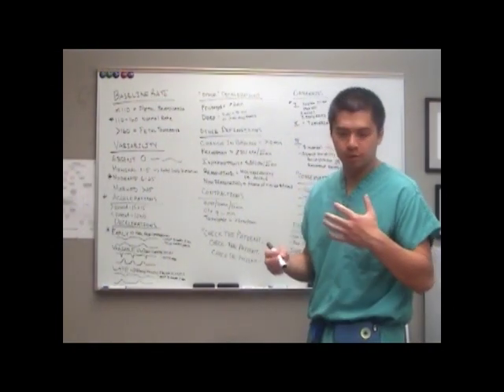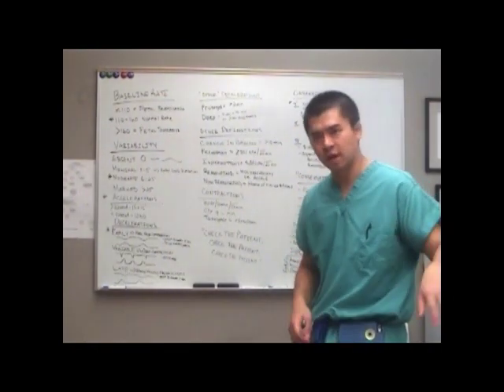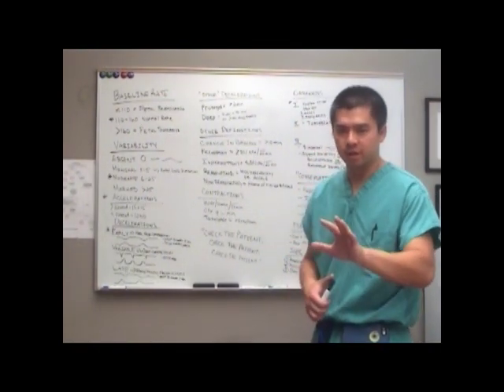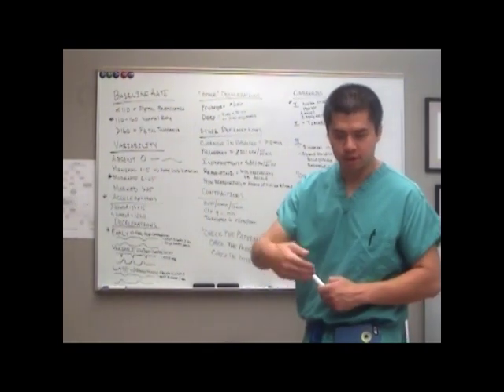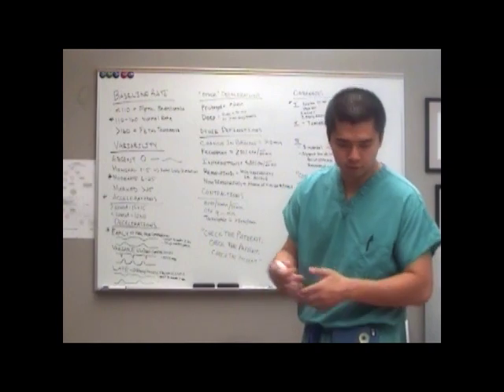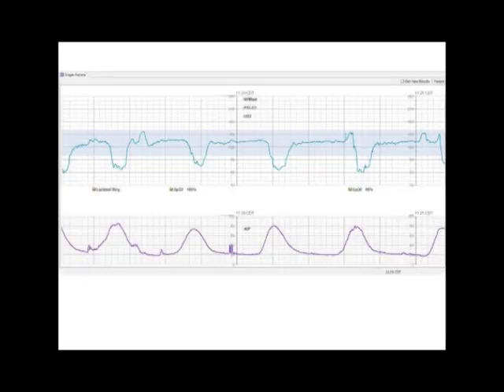And so eventually you'll be able to just look at the screen and say, okay, that's a category 1, or look at a screen and be like, okay, that's not a category 1, and you look at it closer. But you only get there by continually repeating these things to yourself or teaching others as well. So this next example is what category?